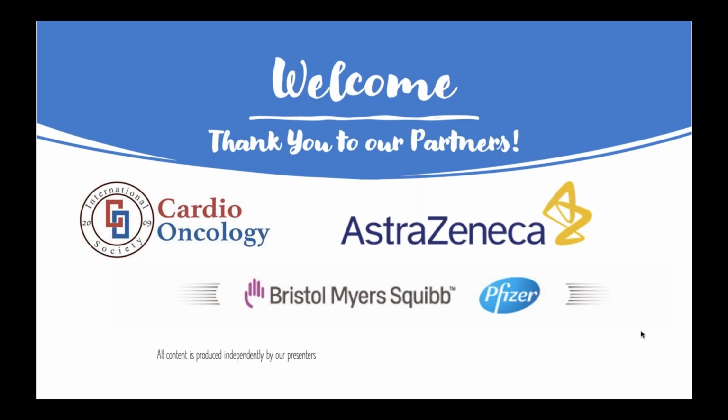And I think Dr. Carver was asking prior about AI. Yes. Artificial intelligence in echo or in MRI, I'm not sure, but we do use artificial intelligence partially for CMR, in post-processing for the LV volume. But we do need to double check and do the contour. That's one example I can give of where we use AI. And there are also programs with AI used in acquisition as well, but I don't think we're there yet where AI can do everything.